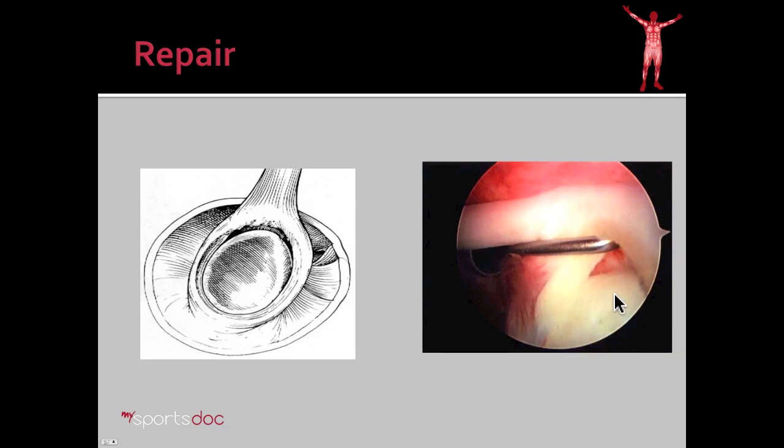Here we have an arthroscopic picture of what that looks like. Here's the biceps tendon coming in. You can see how it's pulled the labral tissue away from the cup or glenoid. What you're going to see in this video is how we repair that. We're going to place two anchors in the bone indicated by these circles here, use certain techniques to pass stitches through the labral tissue, and then tie those down to re-approximate the labral tissue to the cup of the shoulder.